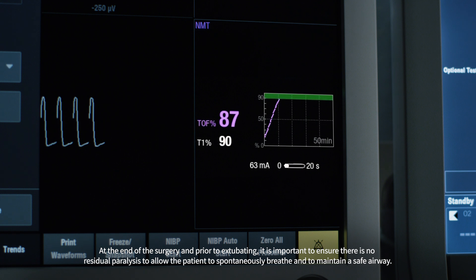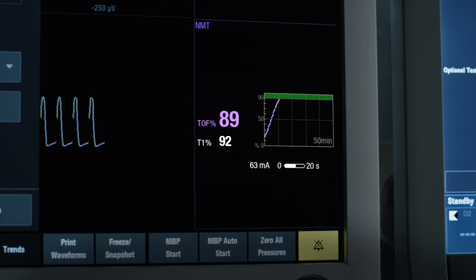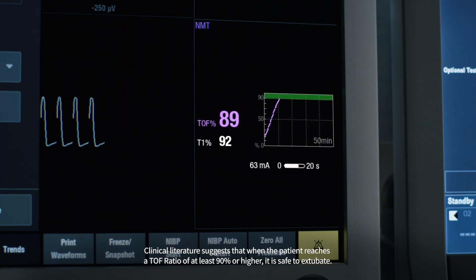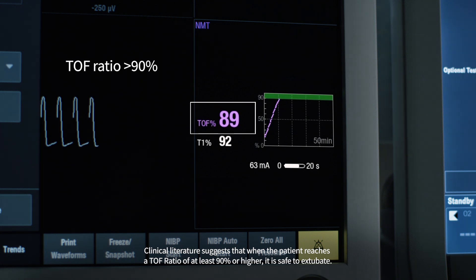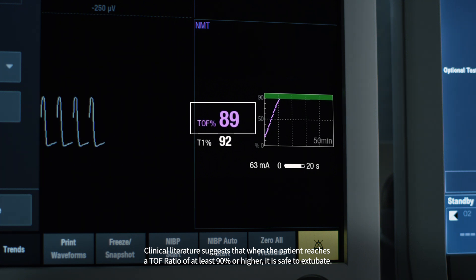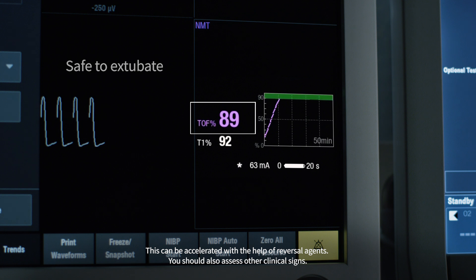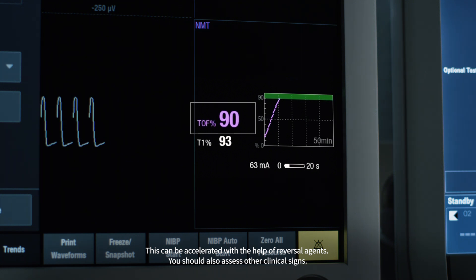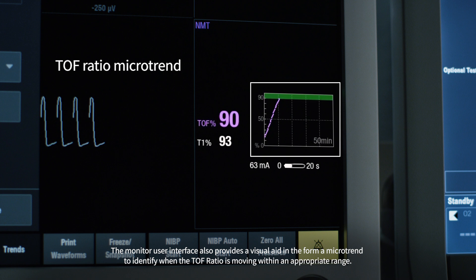At the end of surgery and prior to extubating, it is important to ensure there is no residual paralysis, to allow the patient to spontaneously breathe and to maintain a safe airway. Clinical literature suggests that when the patient reaches a TOF ratio of at least 90% or higher, it is safe to extubate. This could be accelerated with the help of reversal agents. You should also assess other clinical signs. The monitor user interface also provides a visual aid in the form of a microtrend to identify when the TOF ratio is moving within an appropriate range.